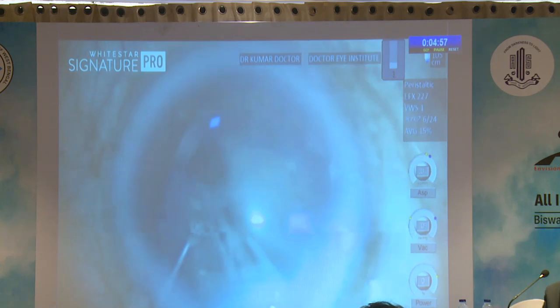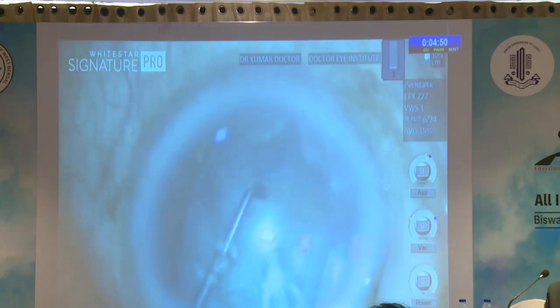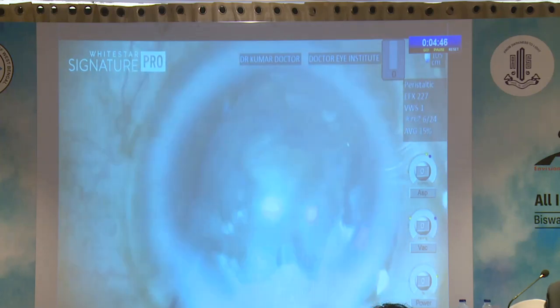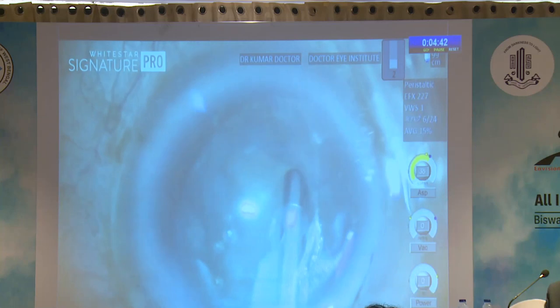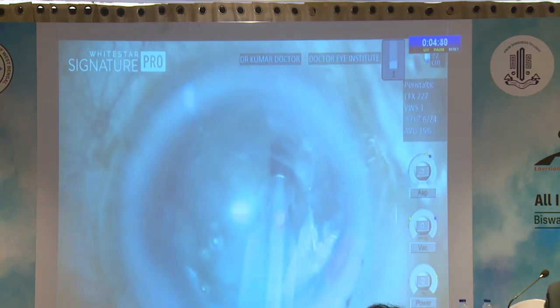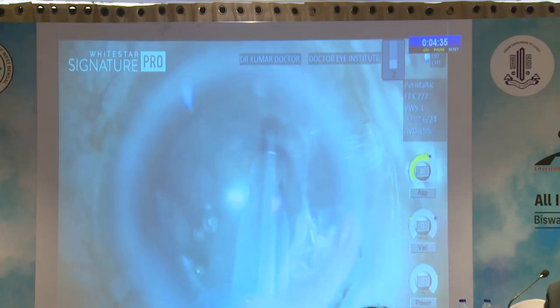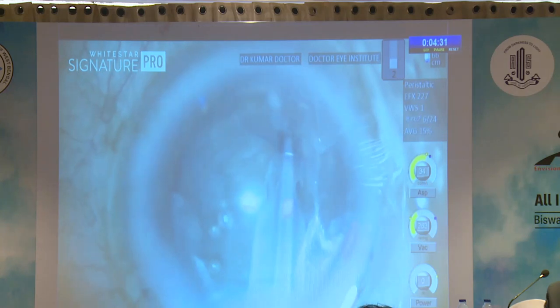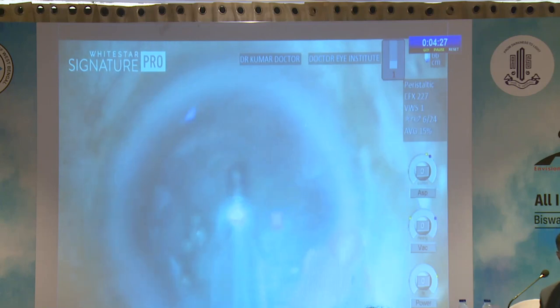Errors at this point. Size of the rexis should have been increased at this point. Now again, as we try to take the nucleus back by reaching out to the periphery wherever it is possible to hold it, that may also increase the size of the rent because the fluid is constantly going down.